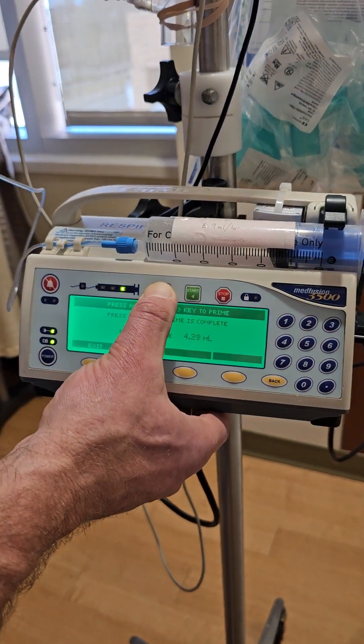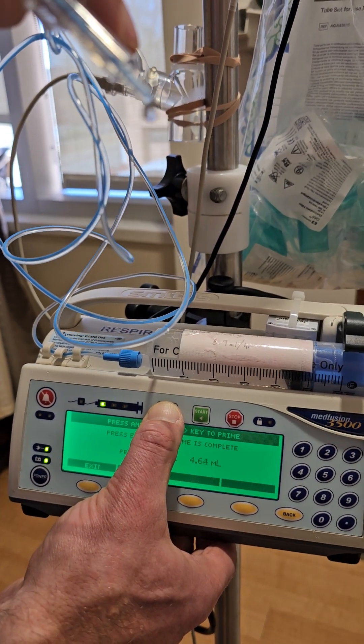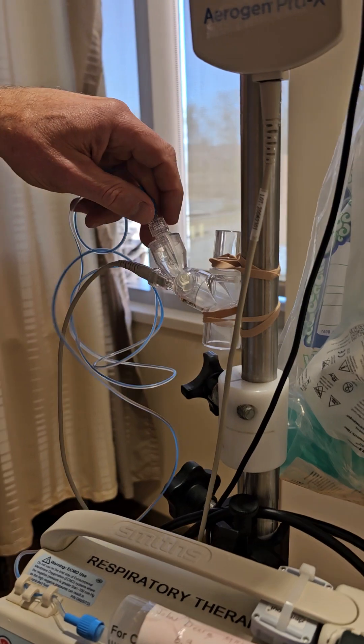We're back and we know we're done priming because we have Flolan dripping out of the end of the tube like that. We can stop pressing the bolus button at this point and we're ready to connect it to the Aerogen nebulizer.